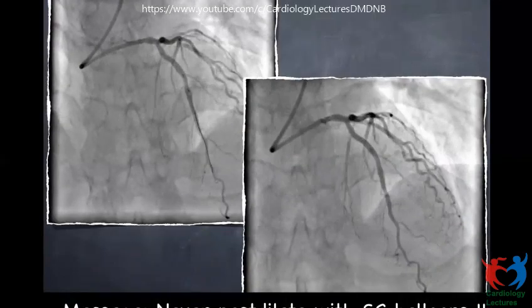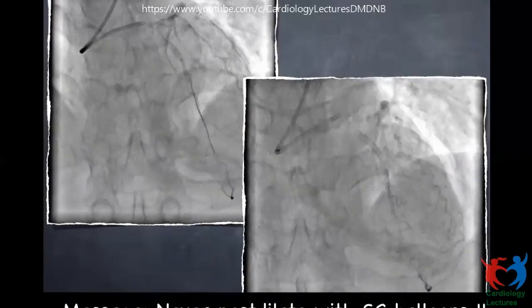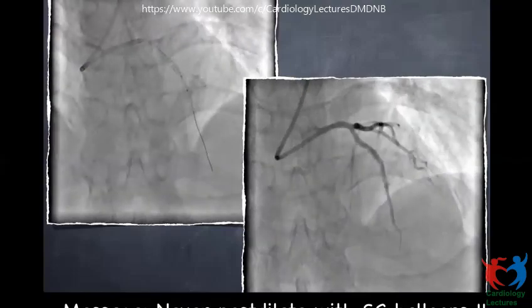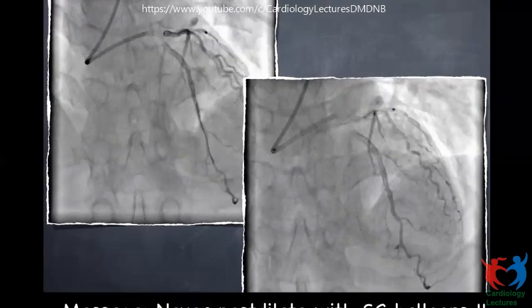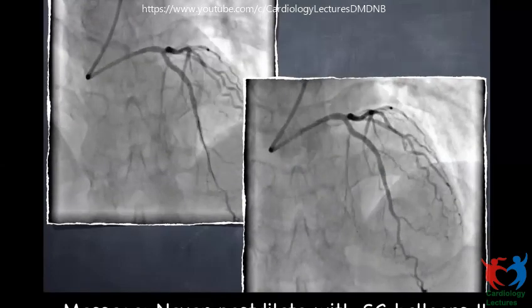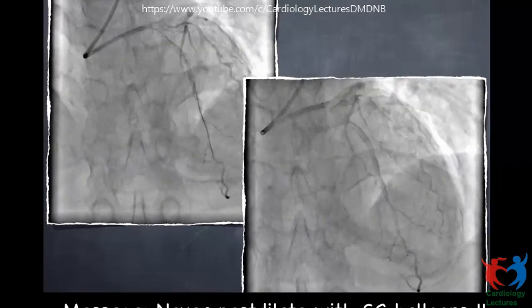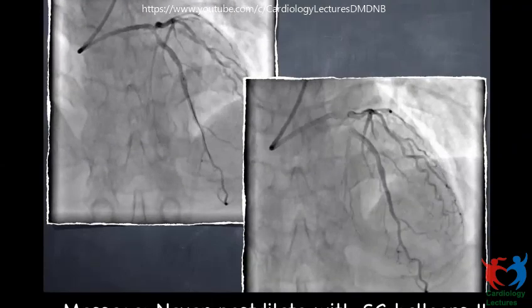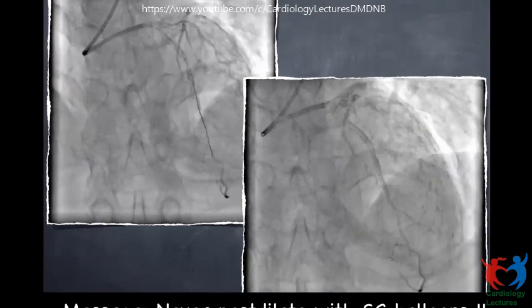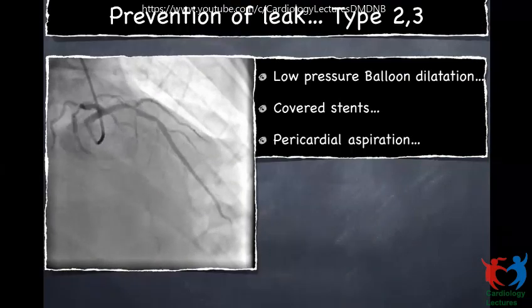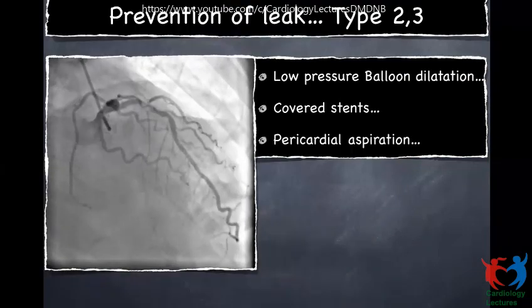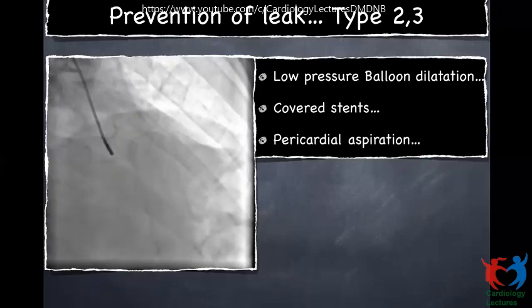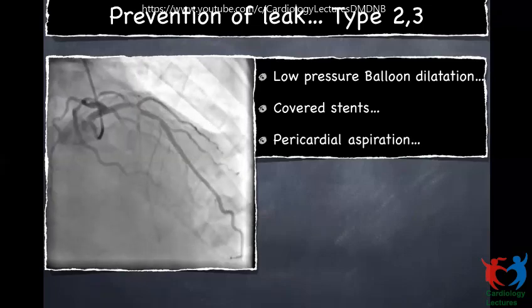Coming back to our patient, we kept the balloon dilated for a while and the perforation slowly healed. We didn't want to further post-dilate in the proximal portion, so we left the patient. The message is: never try to post-dilate any stented segment with a semi-compliant balloon. It always has to be a non-compliant balloon so that you don't have unequal expansion leading to perforation.